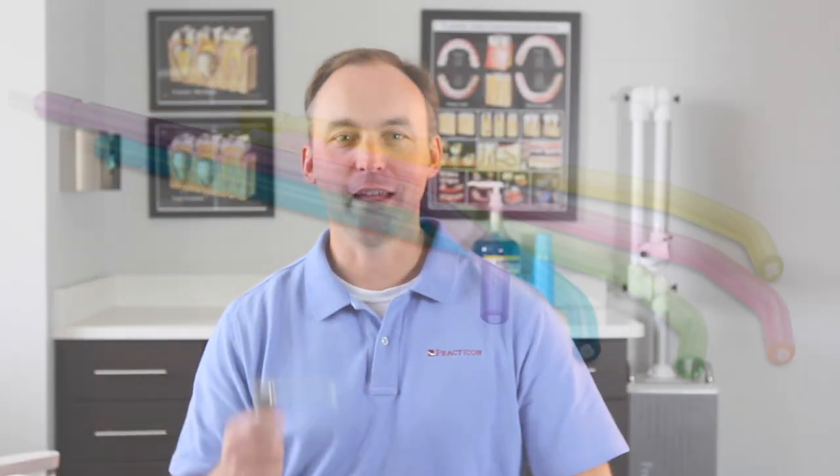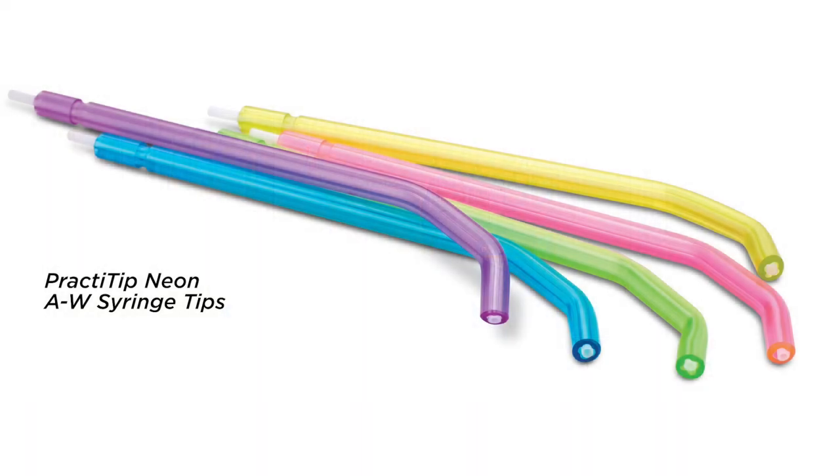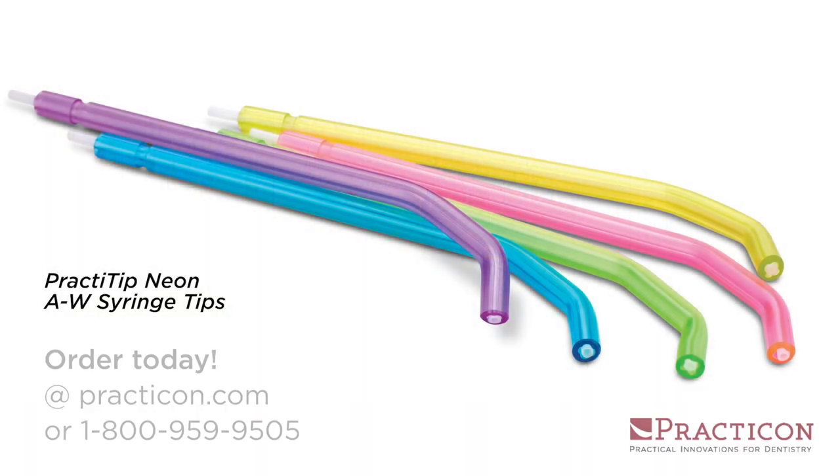Efficient, disposable, and available in assorted neon colors. That's PractiTip Air Water Syringe Tips, another practical innovation from Practicon.